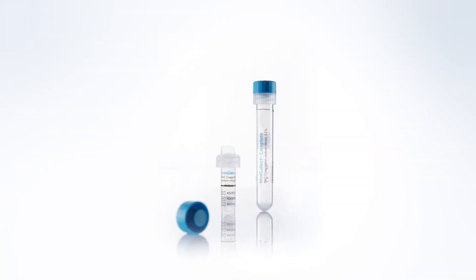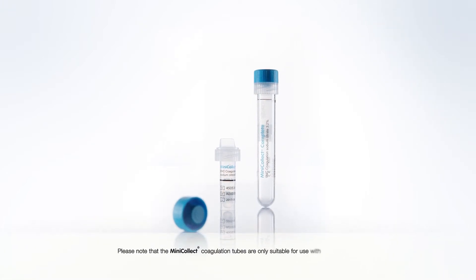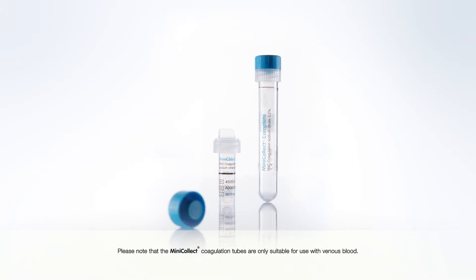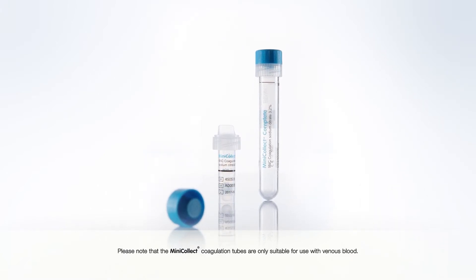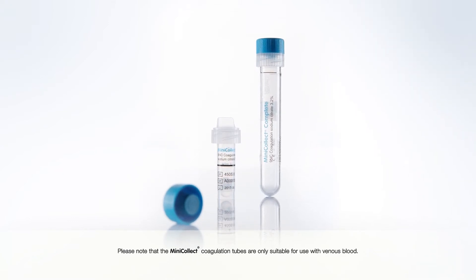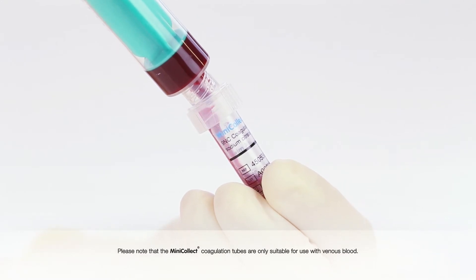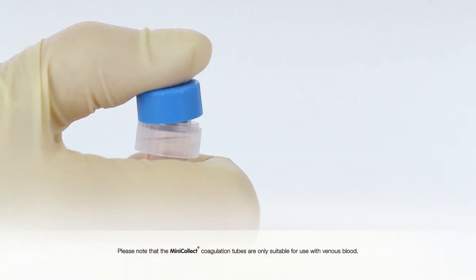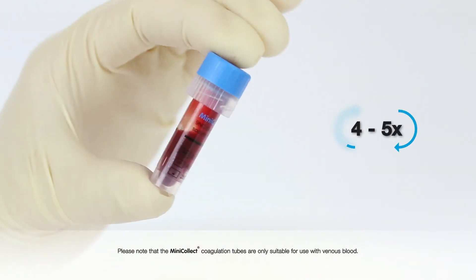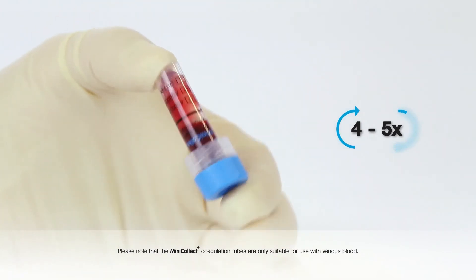To complete our product range, MiniCollect also has a solution for coagulation diagnosis in small sample volumes. Please note that the MiniCollect coagulation tubes are only suitable for use with venous blood. Transfer the sample with a syringe. This tube also has to be gently inverted four to five times to mix the sample with the additive.